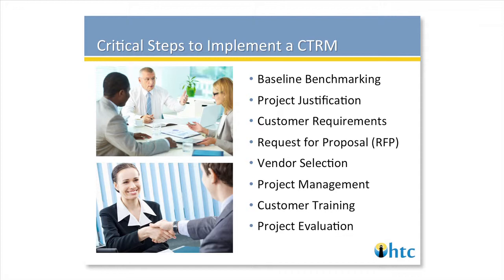Then often clients will decide to develop a request for proposal. This is a formal document that you can then take to vendors that you're interested in, and it will lay out the requirements that are specific to your institution and allows the vendors to then respond to that. From that, you would normally go through a vendor selection process. You will have decided some number of vendors that you wish to have involved. From that, you'll need to narrow that list. There may be some follow-up questions and so forth, depending on the responses to the RFP. And then eventually, you'll probably get down to one vendor.